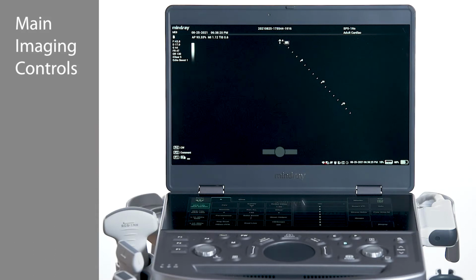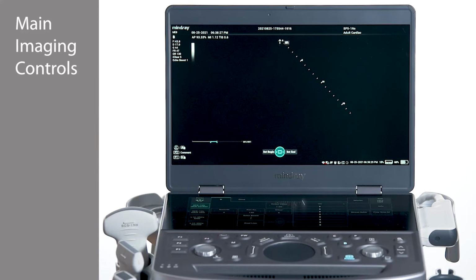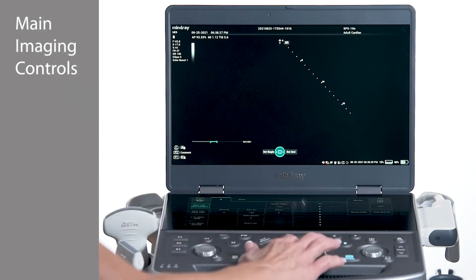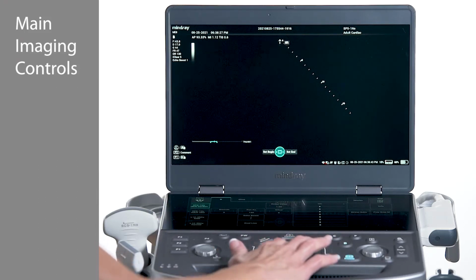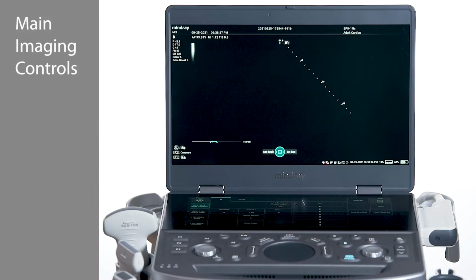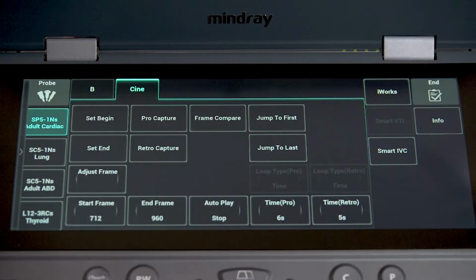The freeze key is located on the lower right side of the control panel. Use freeze in order to measure, annotate, or print an image. Also, when an image is frozen, there is the ability to cine back to review and save previous frames. To cine through the image, swipe left on the touchpad. Other cine functions can be found by tapping the Cine tab on the touch panel.